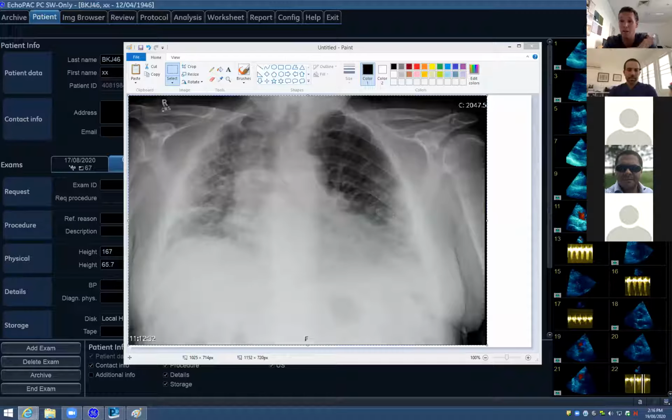I'm going to talk a little bit about echo in patients with ARDS, heart-lung interactions, and I'd like to take you through a case that we've been battling with within the unit, which I think demonstrates some of this really beautifully, and there are some great learning points in this.